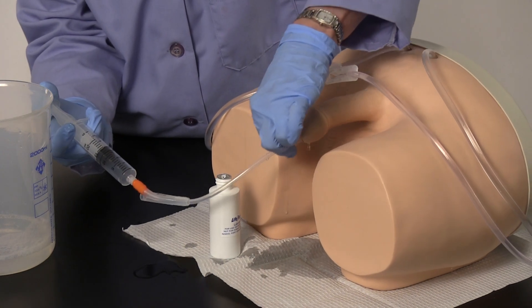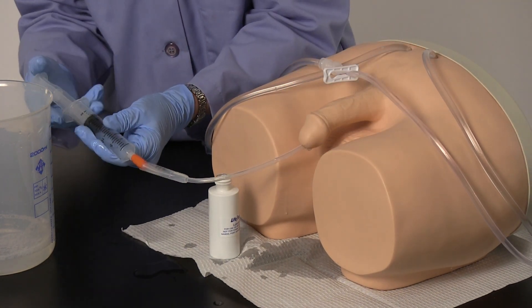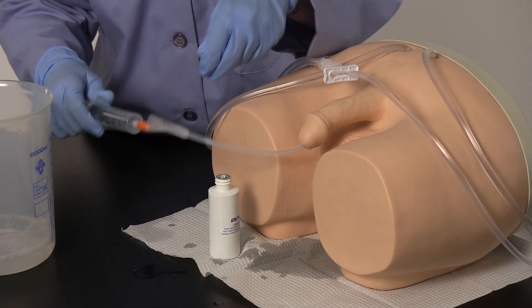Gently tug on the catheter to determine proper inflation. Pull back on the syringe, completely deflating the cuff before removing the catheter.